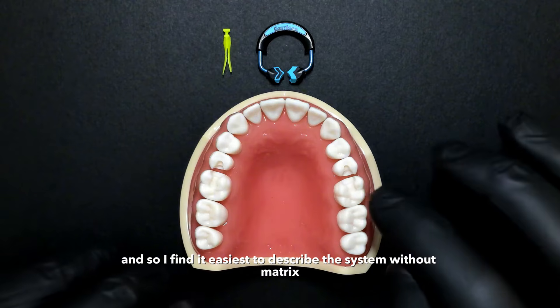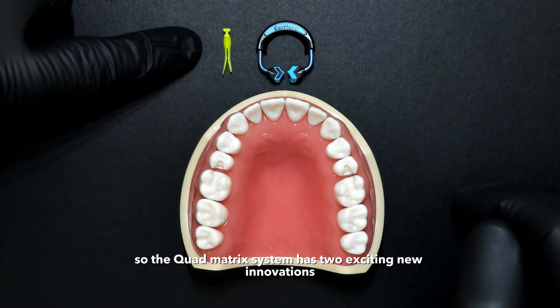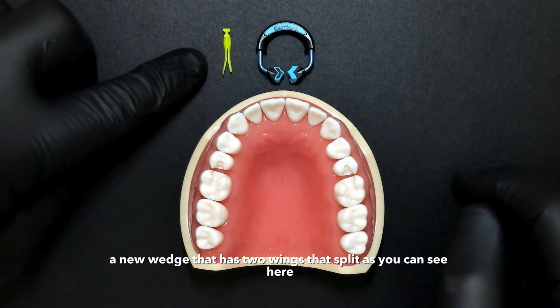I find it easiest to describe the system without matrix bands in place, just so you can get an idea of what this is about. The Quadmatrix system has two exciting new innovations — one of them is a wedge, a new wedge that has two wings that split, as you can see here.